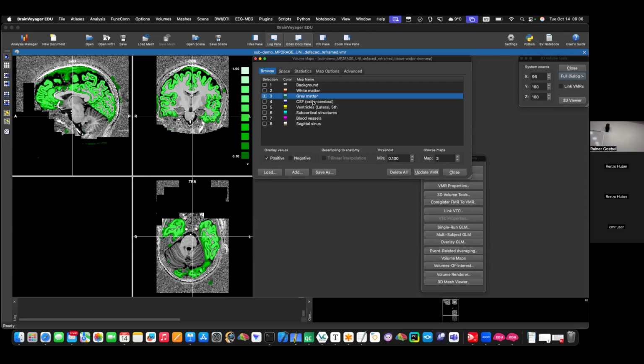So as a follow-up to Rohit's question, if it's working with patches, it means that I can actually also give it a slab. Right? Yes, that's possible as well. But I should say this works on MP2RAGE quality data, not on the other data. It might work with T1 weighting, but I have never tried. Just to be clear, it's trained on MP2RAGE 0.7 data, so don't expect too much.